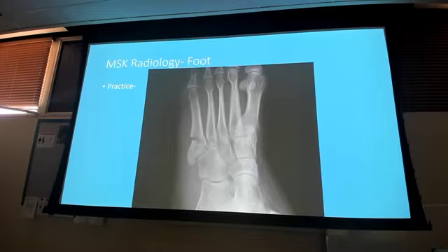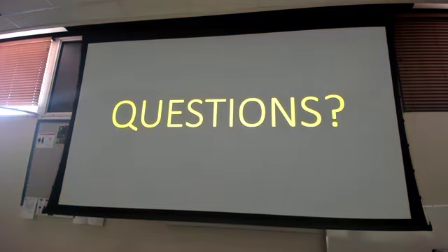What do we call that? Jones, not boxer's, not Bennett's, not Rolando's, Jones. And that is everything in radiology block 1. Congratulations. You can now diagnose all of your active military people with their profiles. Rock on. Questions? Alright. Take 7 minutes till 5 after.